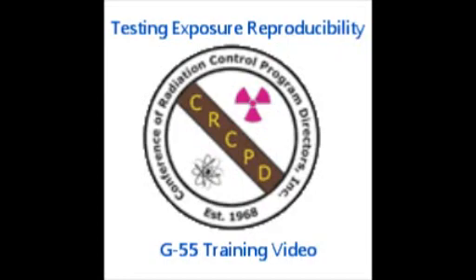Exposure reproducibility is a test to determine whether a given technique setting on an X-ray machine will consistently produce a similar amount of radiation each time the setting is used. Not enough exposure and the image will require a retake, which increases patient exposure. Too much exposure might require a retake, but certainly means unnecessary patient exposure.